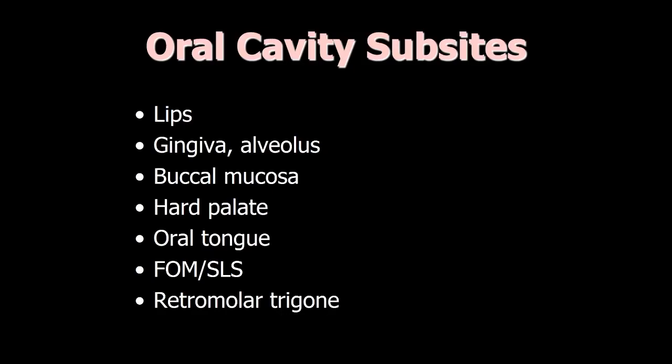This slide shows the various subsites, and going forward we're going to review and have a look at some of them and talk about some of the key imaging features we need to assess.